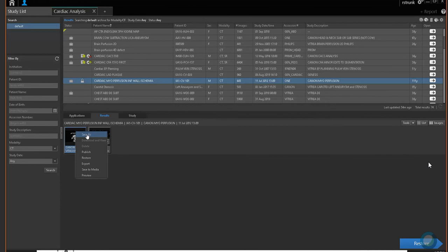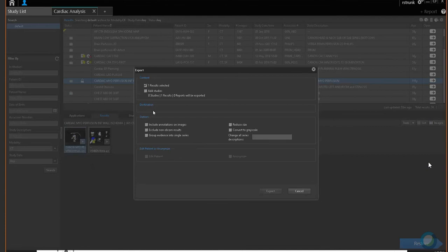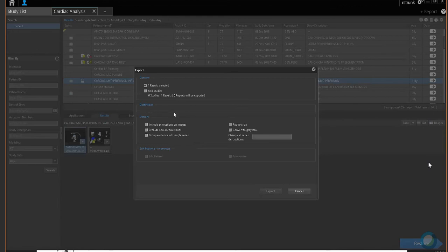Export sends it to the PACS system as a DICOM image, so it can be looked at on any PACS system. You may have a research PACS, radiology PACS, or cardiology PACS — they just have different IP addresses. When you export, there are several destination options listed such as CareStream or others depending on your site configuration.